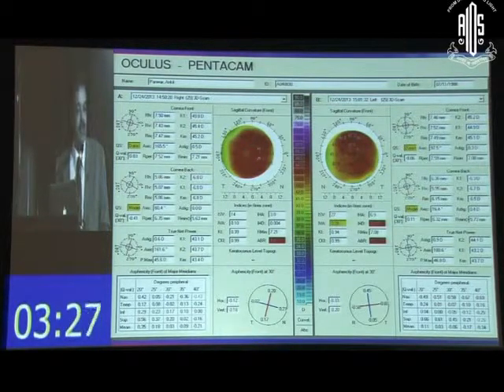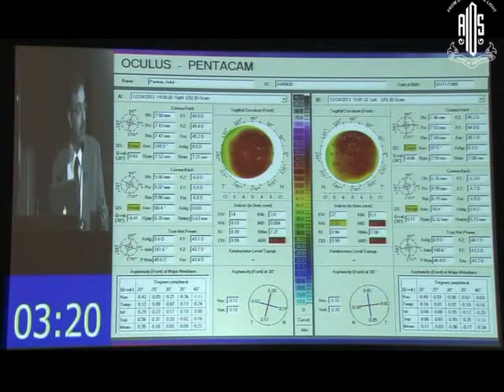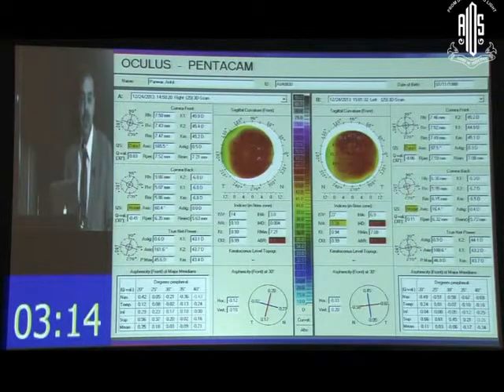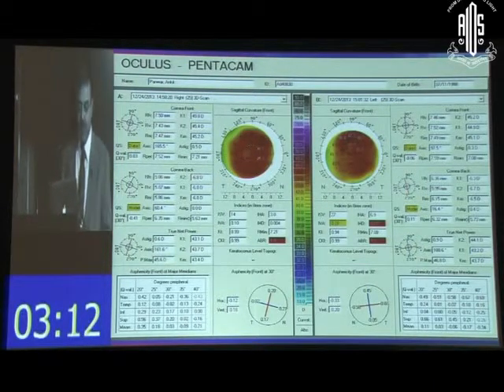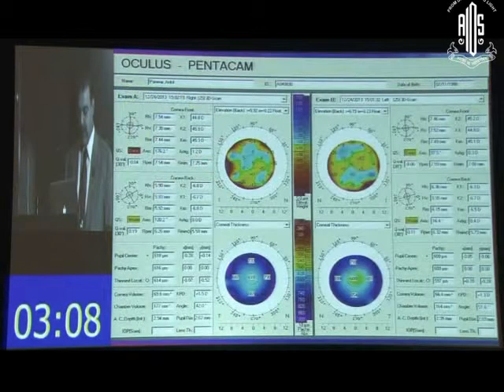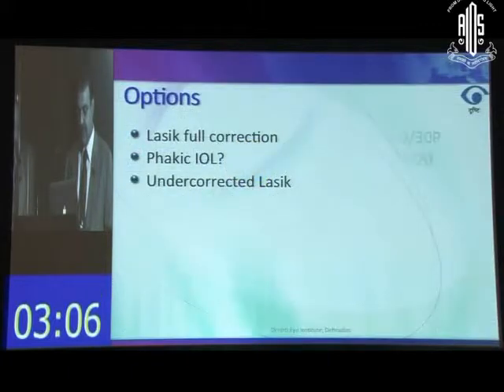So several considerations there. One is that maximum depth of ablation, you have to keep in mind. What optical zone? I also don't go down below 6 anymore. Sometimes with FCAT, I'll go down to 5.9 or 5.8 in pupils who are really small. But the second is the keratometries, and you have to watch out if you're doing a hyperope. So we have another hyperope example coming up. Let's just move on.